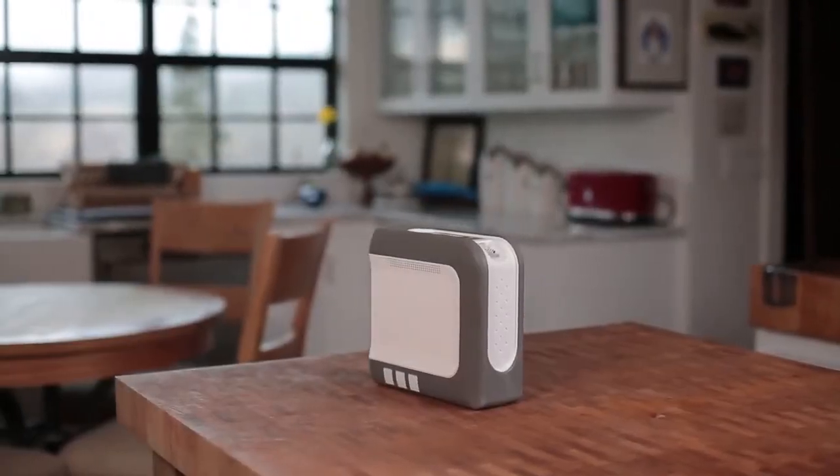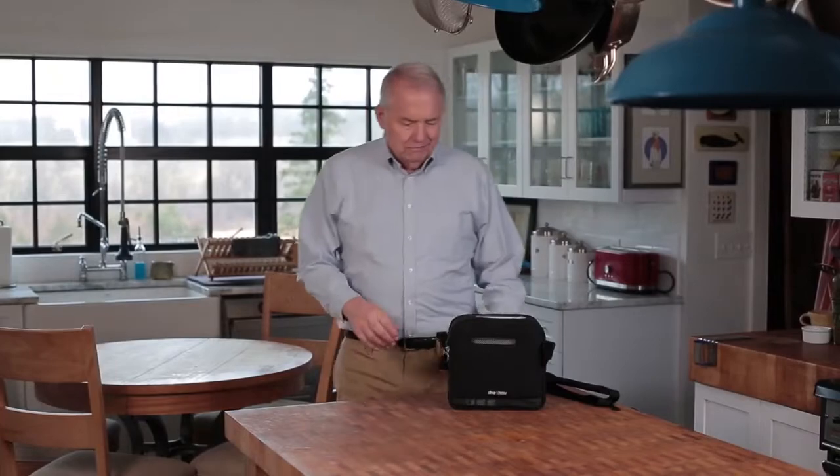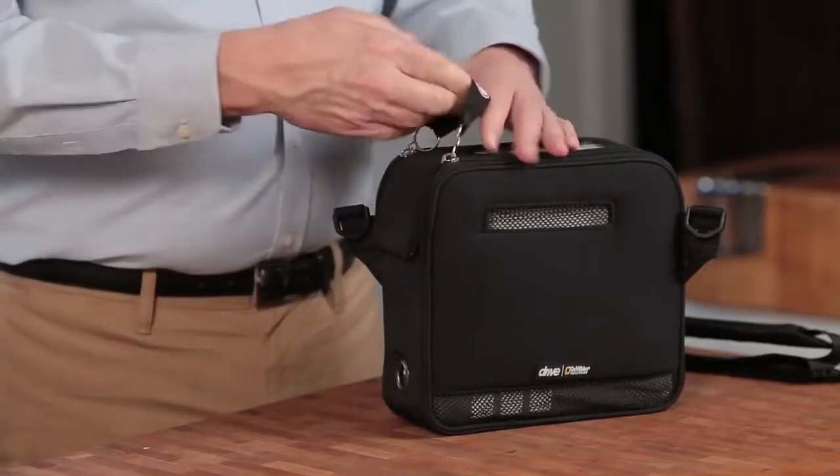Welcome to the assembly video for your iGo 2 portable oxygen concentrator. First, let's unzip the carrying case and remove the iGo 2.